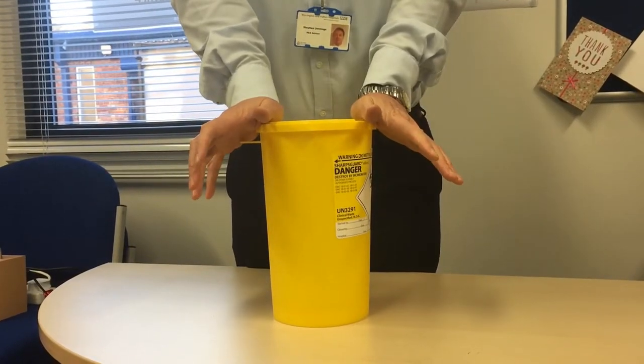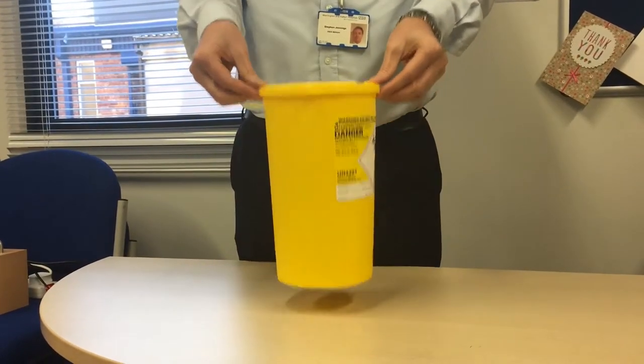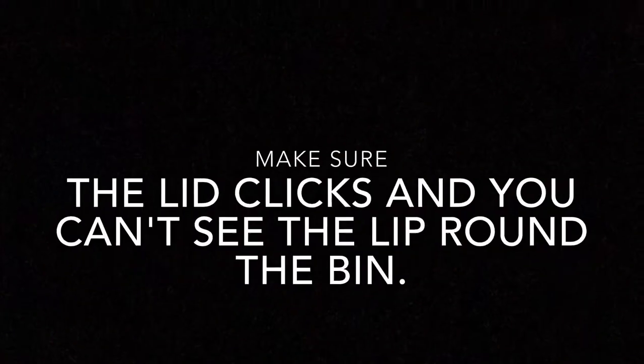Turn the sharps bin around and press again. In doing these two movements, you ensure the whole of the sharps lid is secure against the top of the sharps bin.